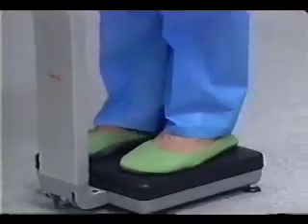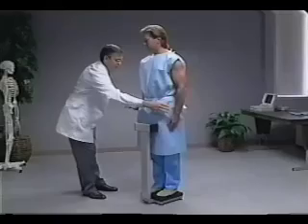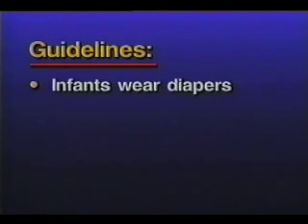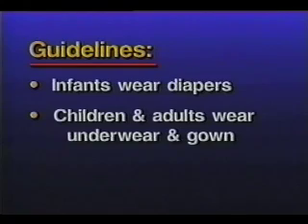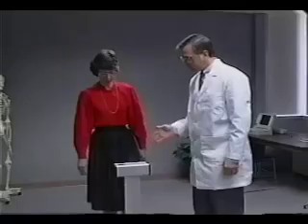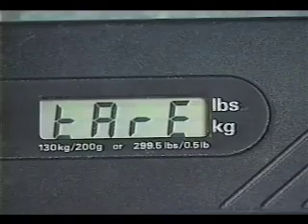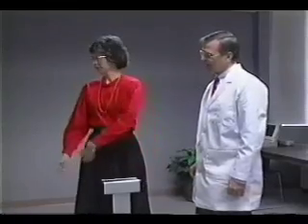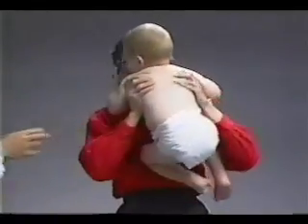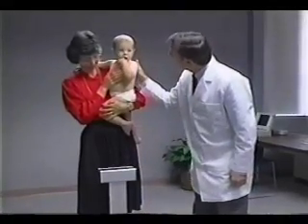The first measurement taken is body weight. In the NHANES III, an electronic load cell scale was used to record weight. The following guidelines are used for clothing: infants wear only a clean diaper; children and adults wear only their undershorts and a disposable paper examination gown with paper pants and foam slippers. For infants and toddlers who cannot stand unassisted, a parent or technician stands alone on the scale platform. Next, the scale is tared or set to zero. The infant or toddler is then held by the person on the scale to obtain only the child's weight. Holding the child provides greater security and reduces movement that might otherwise affect the accuracy of the measure.